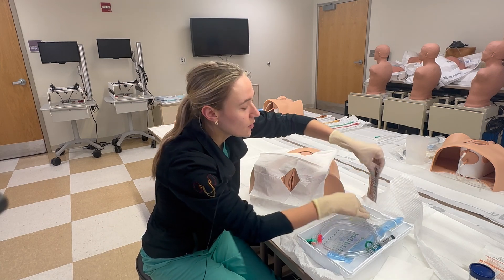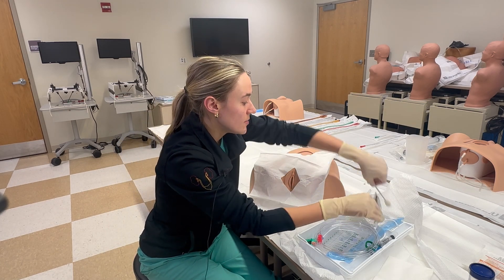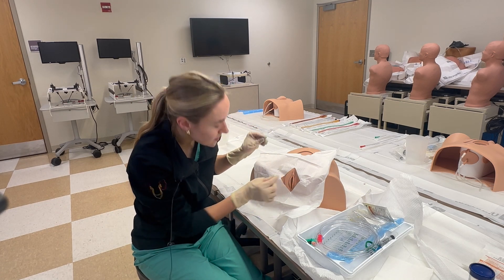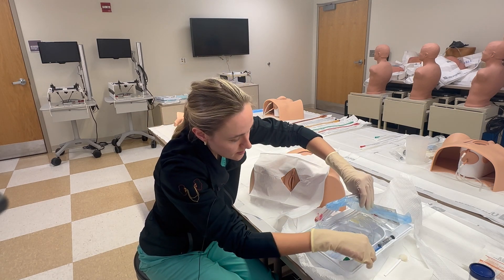We'll grab our iodine — we're not going to actually use it given that this is our model — but pretend that I'm placing the iodine on the swabs, and then I would go ahead and make sure that I really get in and disinfect as best as I can. I would use all three swabs for that.